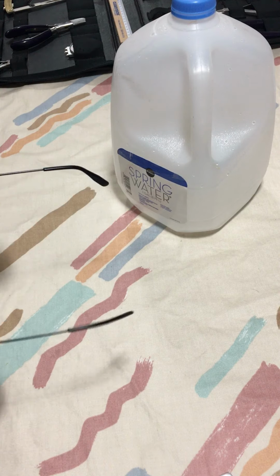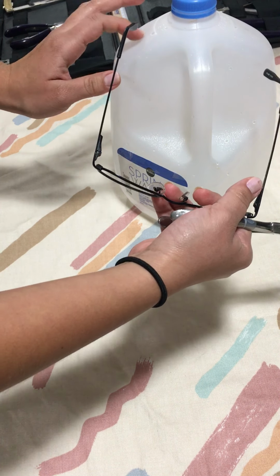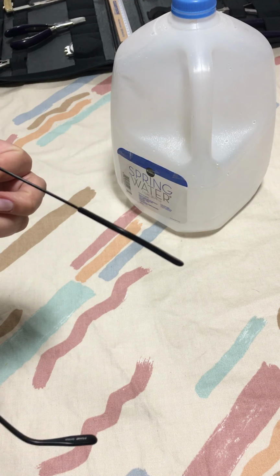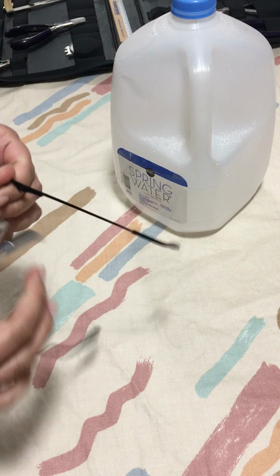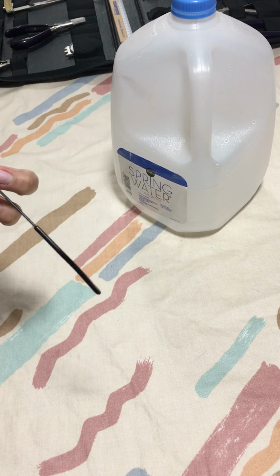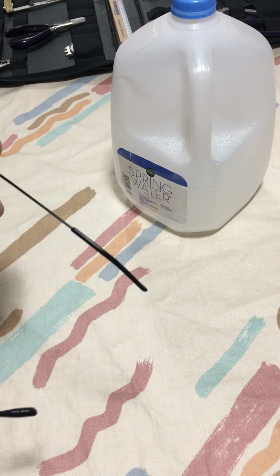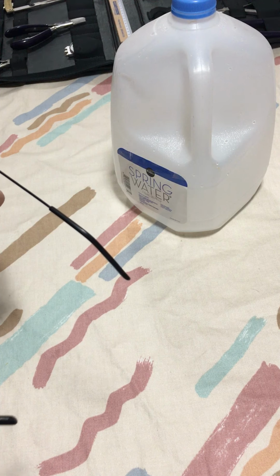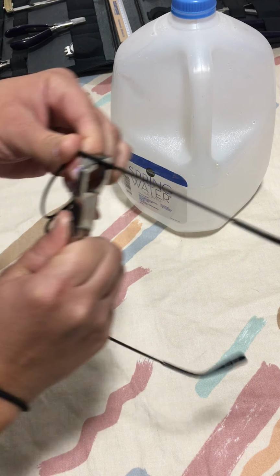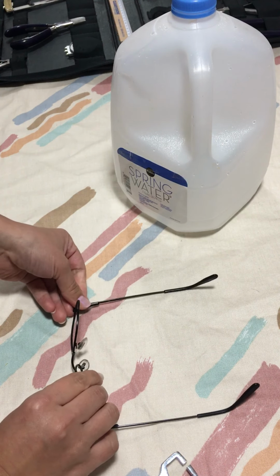So using my wide angling plier, what I'm gonna do is, since the right side was more up, that's the side that I'm gonna raise up, okay? So I'm gonna be using it this way. So I'm gonna be putting pressure with my fingers right here on the end piece. And I'm just gonna push it upwards. Push it upwards. Okay, so I'm gonna check on the table.